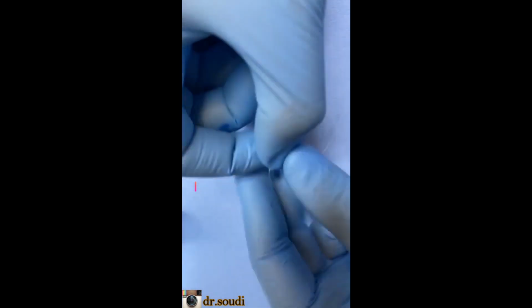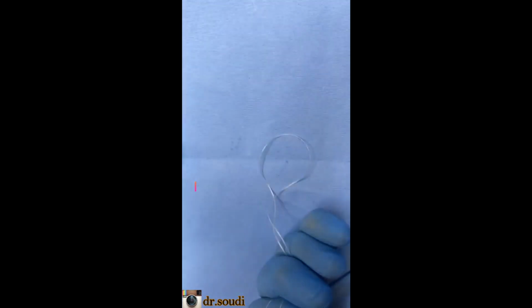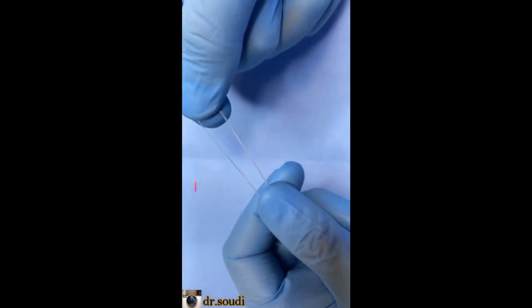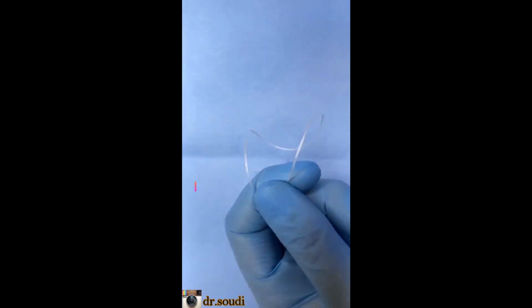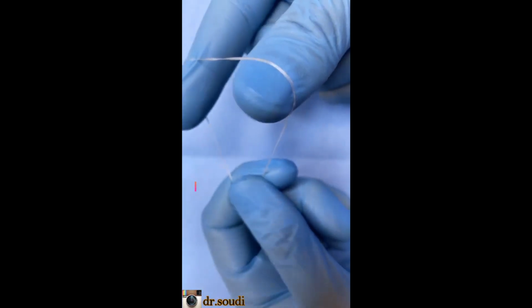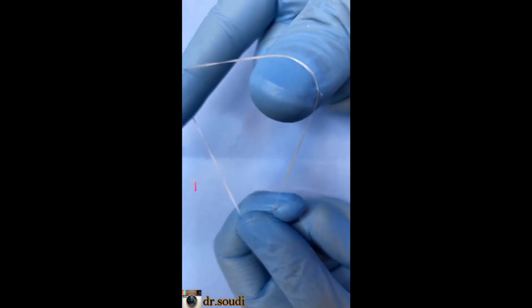In English, sorry, for the floss tie we need a large part or a tall part of floss, a waxed one like this, divided into 2 pieces, okay, like this. And look at it, you have a loop here. Put your 2 fingers like this, okay, and like this, make a triangle. You can see it now.